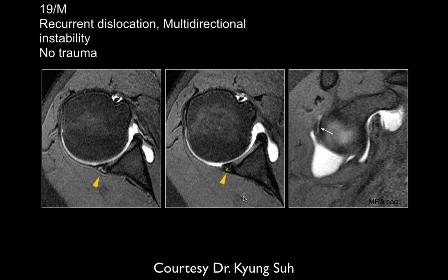So just regarding the morphology of the posterior labrum, it looks like it's serpiginous, this signal. Is that a paralabral cyst component of it as well? No, I wouldn't call that. That's actually the tear. That's just the tear in the labrum. The periosteal attachment is over here. This is all labrum in this location. So this is just a tear in the labrum, and here's the periosteal attachment.